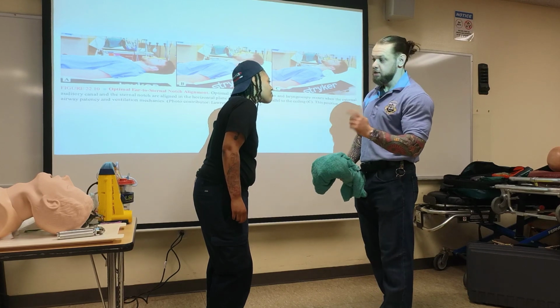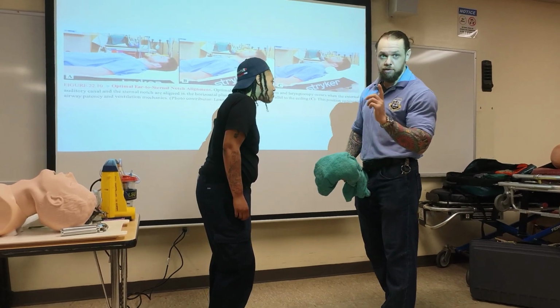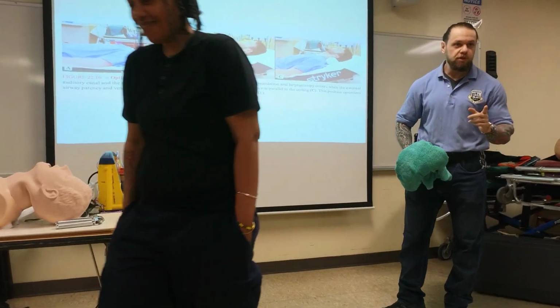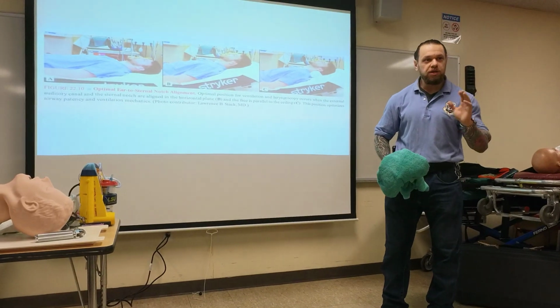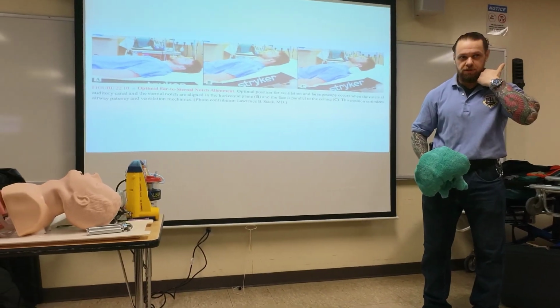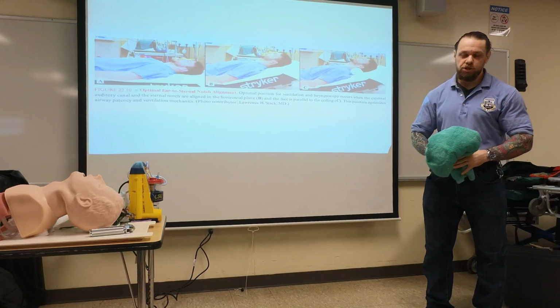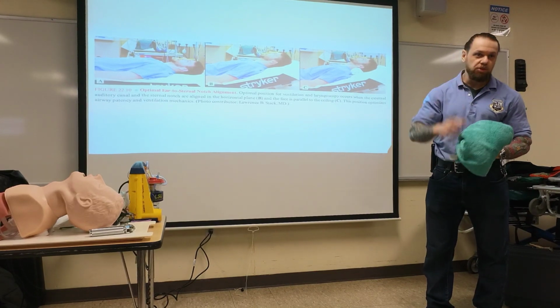Everybody see that, right? This is the sniffing position, right? That you want to employ. Thank you so much, right? This is the sniffing position you want to employ, but the caveat to that, only for patients who do not have cervical spine injury. Once we get to the trauma lectures, we'll explain to you the modification there. But for the patients you don't suspect spinal injury, that's the position you're going to take.